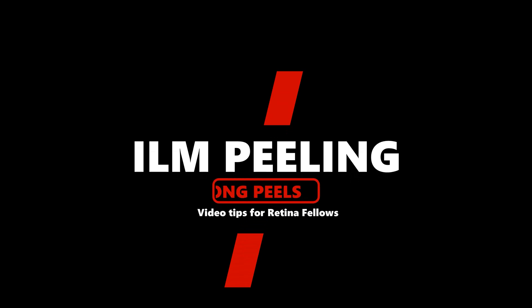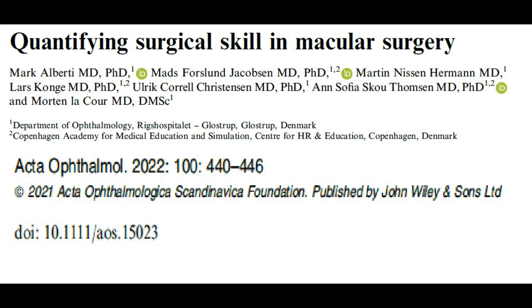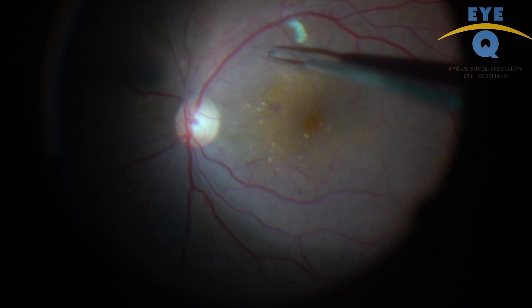There are a lot of tips available on successful ILM peeling. Some of these tips include the pinch and peel technique, restaining to find the edge, pause for blanching of retina, planning your peeling strategy beforehand, and many more by different colleagues. A recent publication reported that beginners are more likely to make repeated attempts to grasp ILM, resulting in higher forceps-induced damage to inner retinal layers.